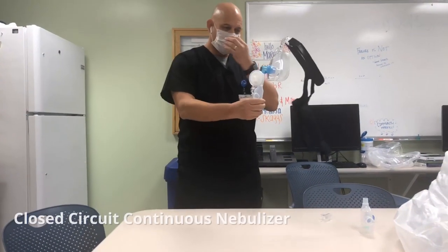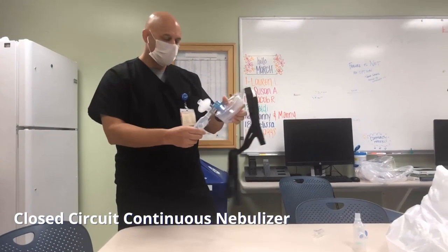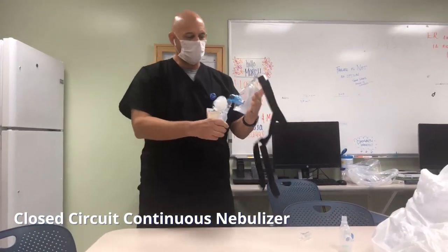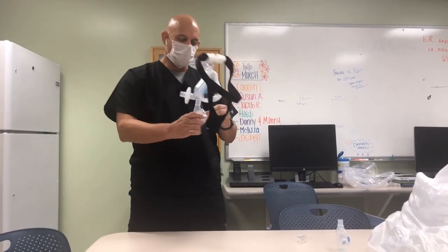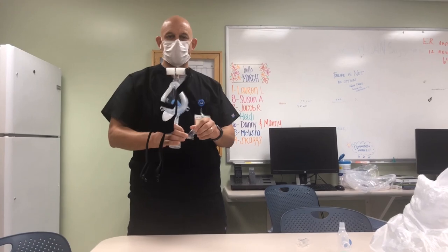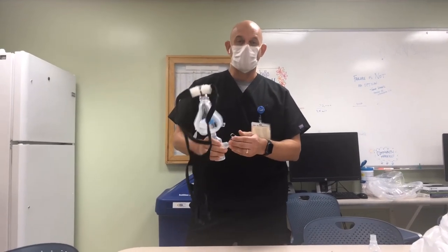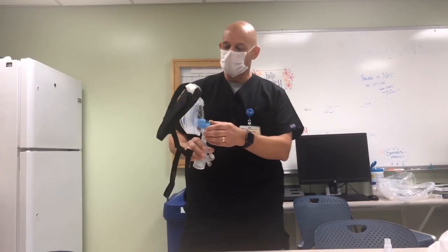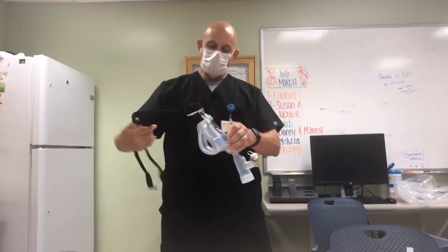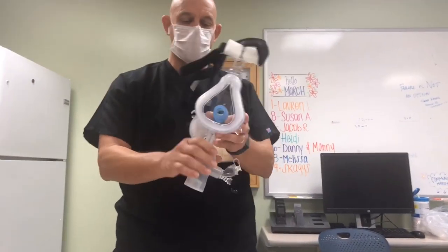What we've got here is a system to give continuous albuterol to a patient while giving constant pressure — CPAP. The plan was to use MDIs, but for patients in severe distress, particularly pediatric patients, we need to give them a little bit of pressure because they're hypoxic. They need treatment to open up their airways. So what we've done is put together a BiPAP mask — this is a large one, but we'd have a small one for pediatric cases.